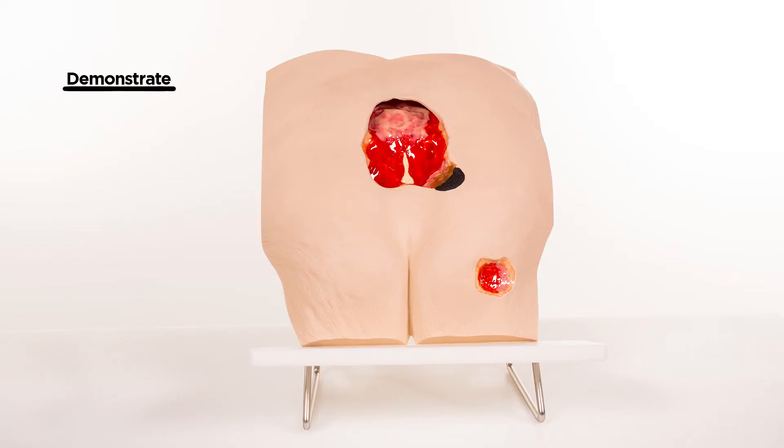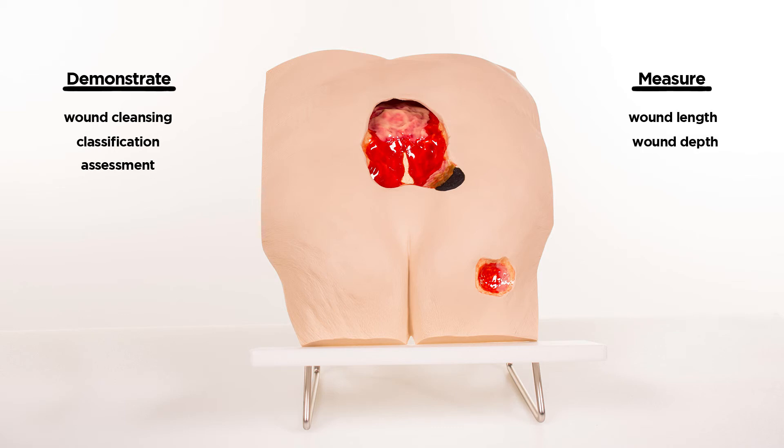You are able to demonstrate and practice wound cleansing, classification, and assessment, as well as the measurement of wound length, depth, undermining, and tunneling — a great teaching tool for healthcare professionals.